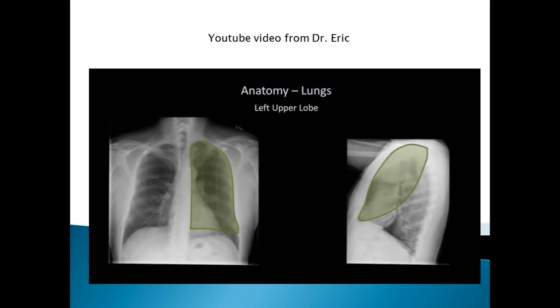And then this is a really good website where you can see a gallery of a lot of different types of abnormalities in chest X-rays and other X-rays. And sometimes people just like to look at that because they're interested in reading X-rays. So hopefully this has been interesting. And like I said, be sure to get out there and read as many chest X-rays as you can.